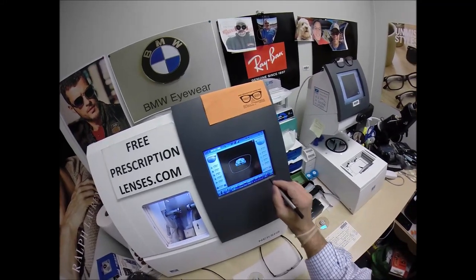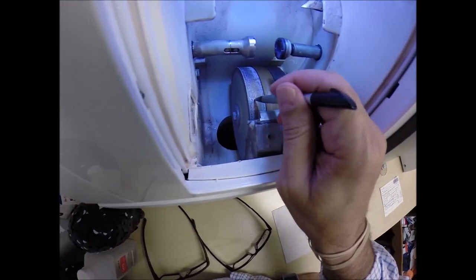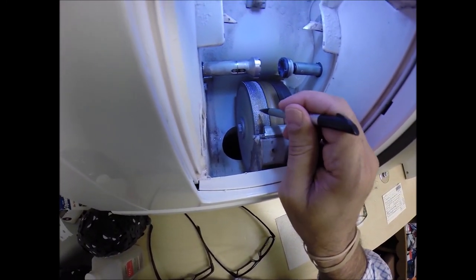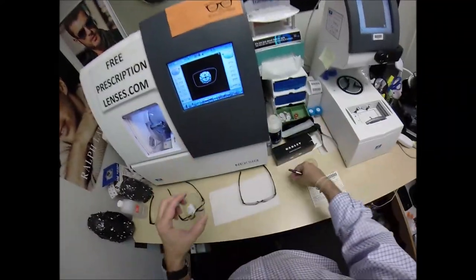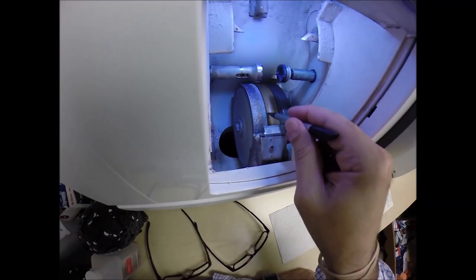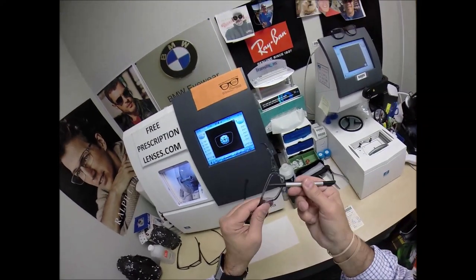Oops, I just turned it off. There we go, back on again. So now the magnet's going to do its job. Well, actually, the cutting wheel is this diamond crusted wheel that's going to act like a heavy grit sandpaper that's going to grind away your lens material from this size to this size. This wheel in the center that has that channel, that little bevel, that's what's going to put the V-shaped bevel onto the lens so it stays inside the bevel of the frame.